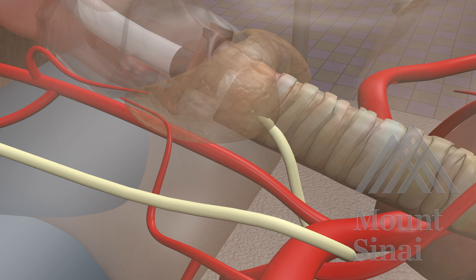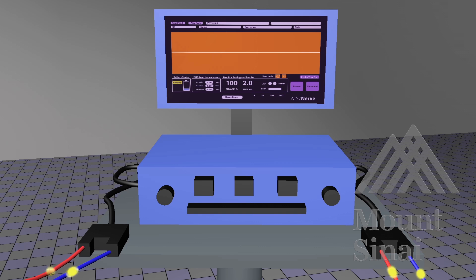A nerve monitor works by stimulating the nerve with an electrode that sends an electronic current through the nerve, which in turn stimulates the vocal cords to move. Stimulation is manifested as an audible sound and as an EMG waveform created on the nerve monitoring device, as seen here.